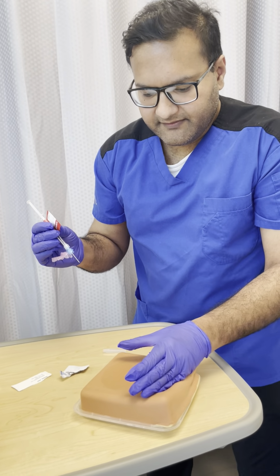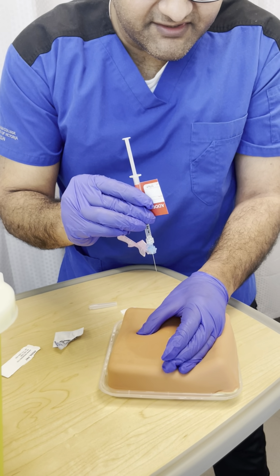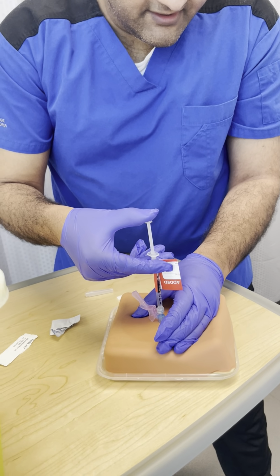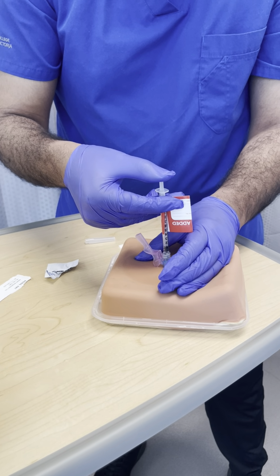So with that, using the Z-track method technique, once I grasp a little area, I'm going to go 90 degrees in a dart-like motion. After doing so, I'm going to slowly inject. Once I have injected all, I am going to wait 10 seconds before removing the needle from the injection site.